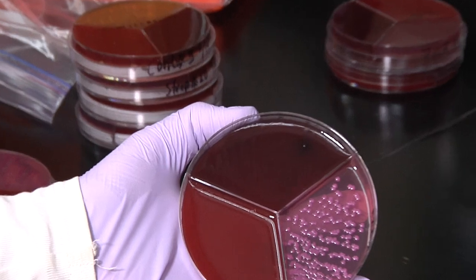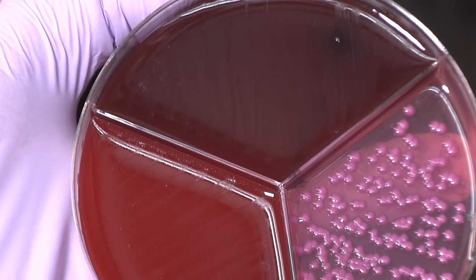For example, if you have 3 or 4 colonies that you're sure are Staph aureus, we would consider that a good diagnosis. But if you've got 2 or 3 colonies of E. coli, or as shown here, 1 colony on the strep segment of a triplate, in most instances, we wouldn't be confident that there's enough colonies there to make that diagnosis. And we would typically call that non-significant growth. This is a tricky diagnosis, and one of the things we'll recommend in both diagnostic laboratories and when we're doing on-farm culture is, if you think you have non-significant growth, put the lid back on that plate, put the plate back into the incubator, and re-examine that plate 18 to 24 hours later. At that point, you'll be much more confident in making that diagnosis.